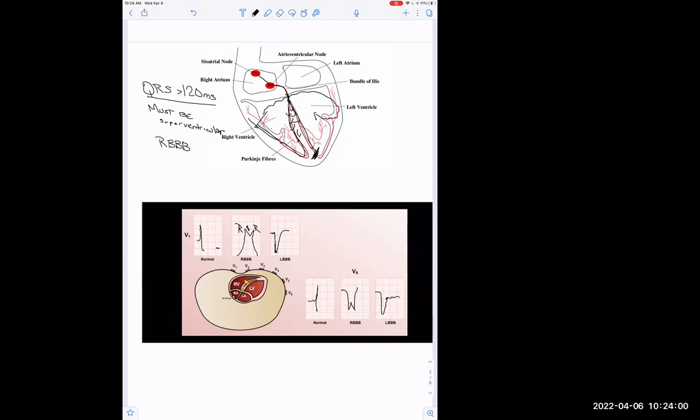For many years, it was said that, oh, you can't do it. If someone has a left bundle branch block, you're just better off, if they're having symptoms, going ahead and treating them for an MI because there's no way you can determine that a STEMI exists. And it turns out that that's not true. So this time we're going to take about another, let's take 15 minutes. And I'm going to go stick my iPad back in the refrigerator.